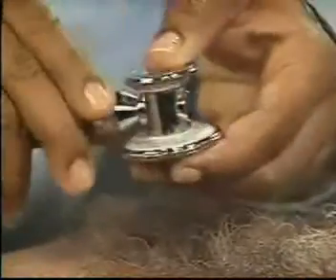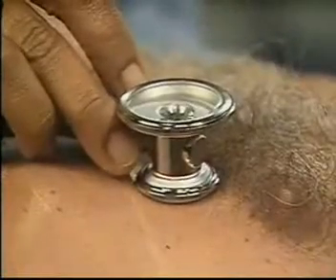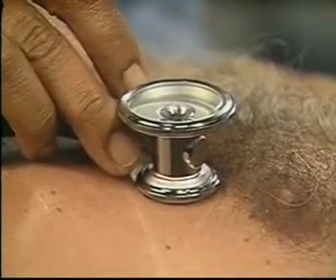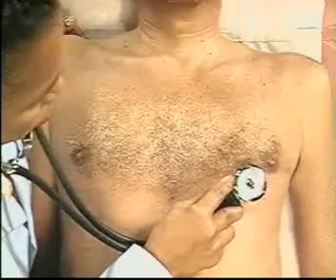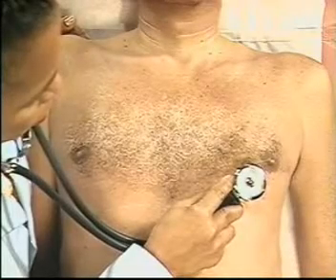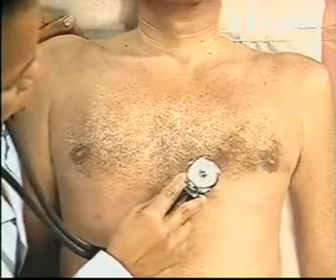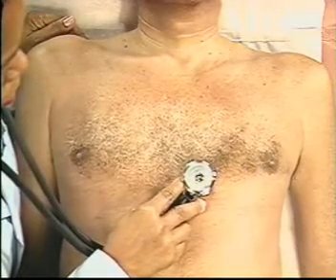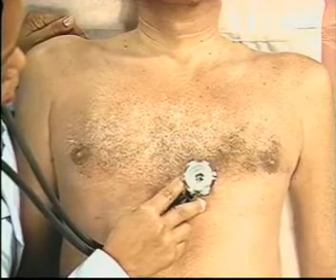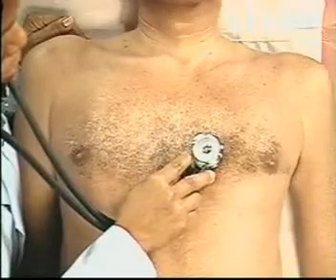Now switch to the bell of the stethoscope, which is more sensitive to low-pitched sounds, such as S3, S4, and the murmur of mitral stenosis. Listen at the apex again, in the fifth interspace, and in the fourth interspace.